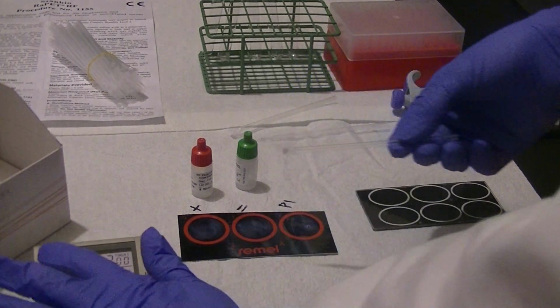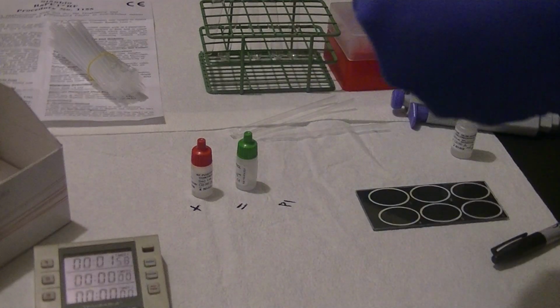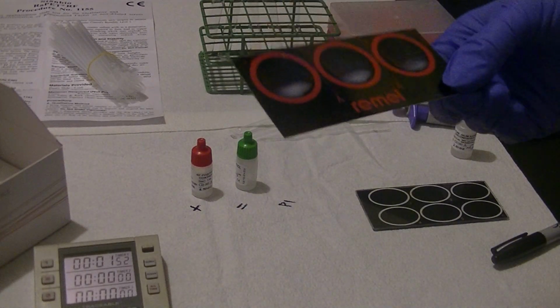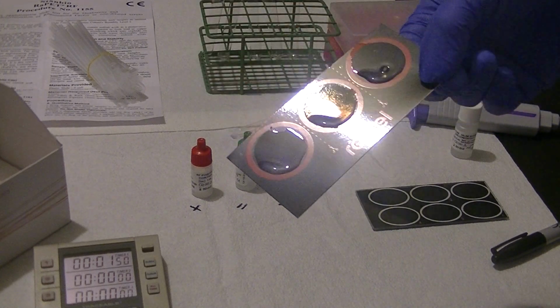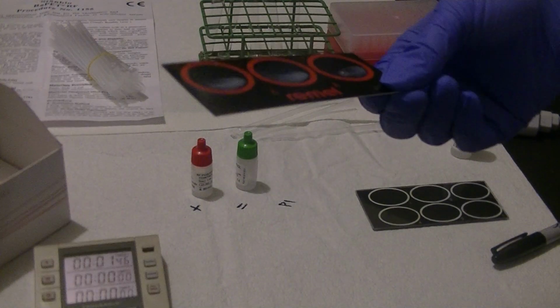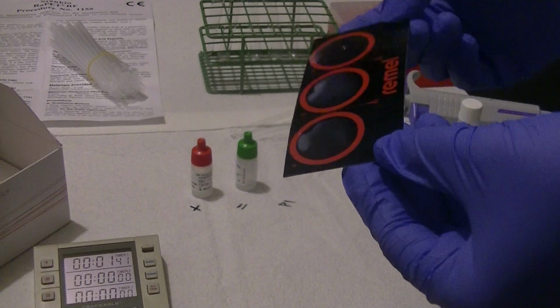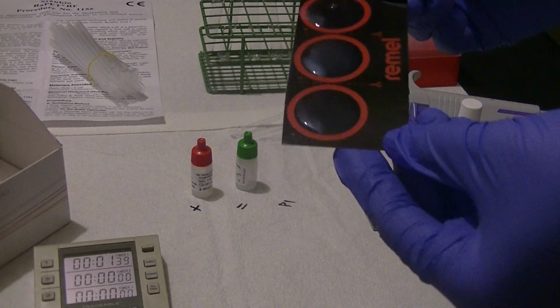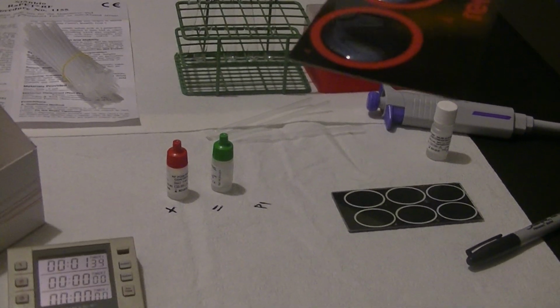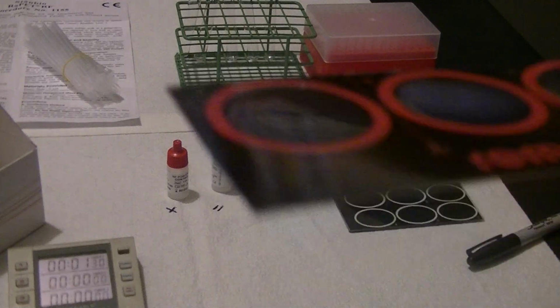And then I'm going to start a timer for 2 minutes. In the directions it mentions this is a 2-minute reaction. And I'm going to make sure that I rotate this card for 2 minutes so that the latex particles and the patient sample have a chance to actually come in contact with one another, so that antibody attached to the latex particles can come in contact with any rheumatoid factor that is present in the patient sample.